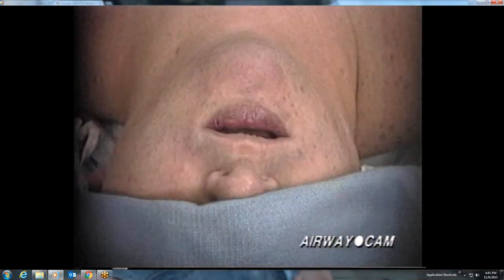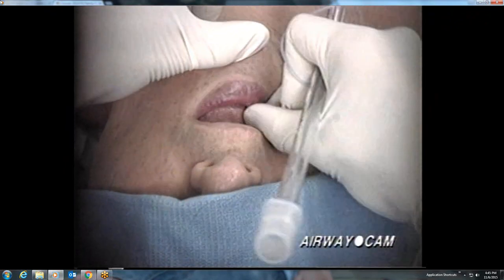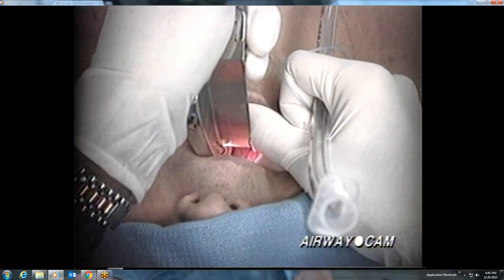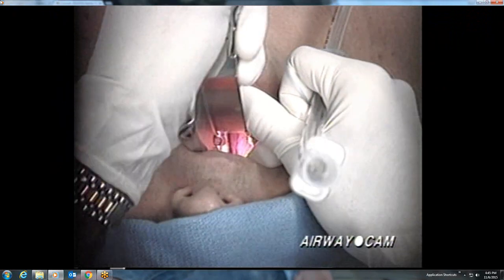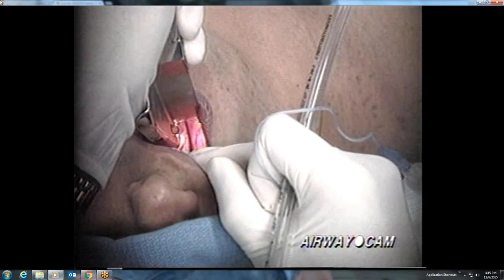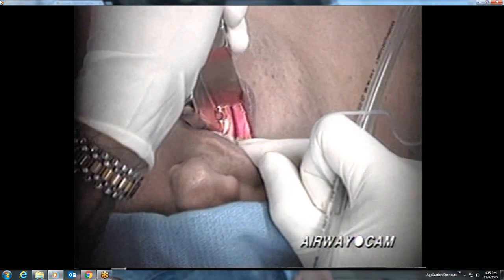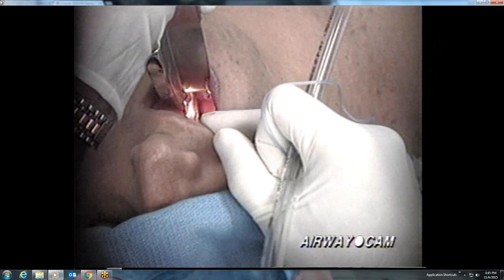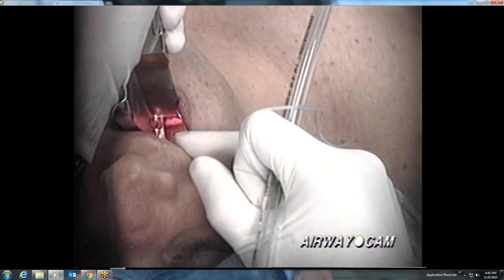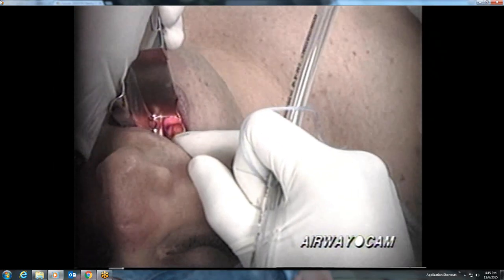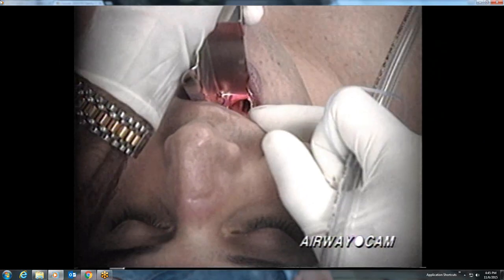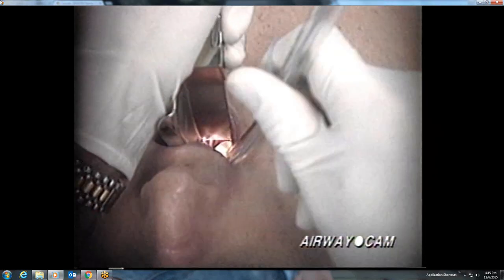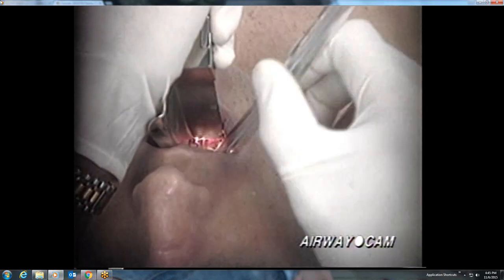The next intubation is with a Macintosh No. 4 blade on a young man. Following a scissor technique opening of the mouth, the posterior pharynx is visualized, and the blade is further advanced until the tip fits into the vallecula. The edge of the epiglottis and the posterior cartilages become visible. While maintaining a view of the target, the tube is passed down the right side of the mouth.